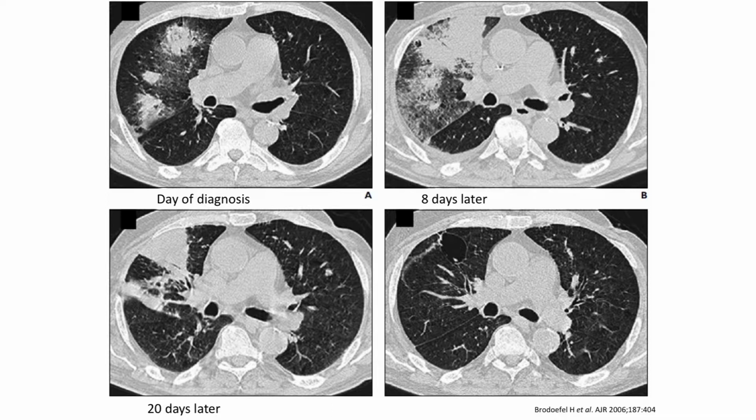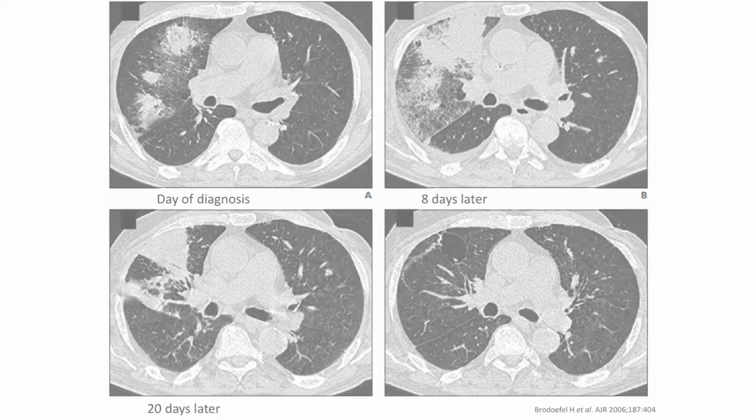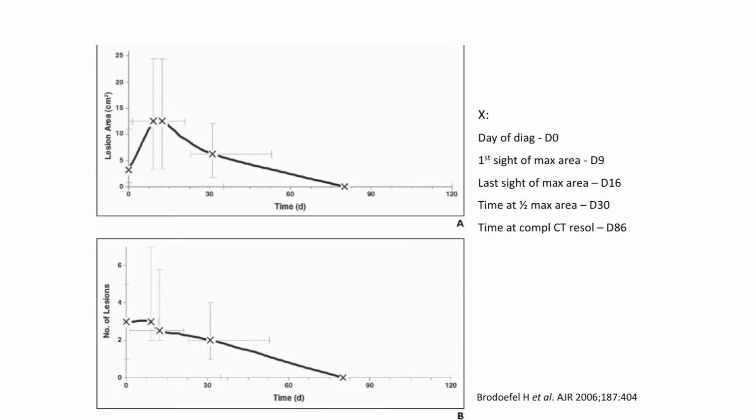And in time to come, irrespective of therapy, some of these will coalesce. As you can see, there's a hint of halo still, but it will take almost up to a month, 2 weeks after this, before you will see some shrinkage. And it will be 3 months before it will be reduced to a scar. Because they had more than 300 scans, they could represent this graphically.